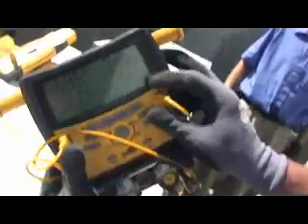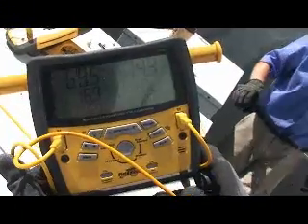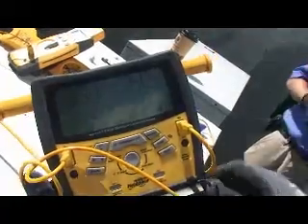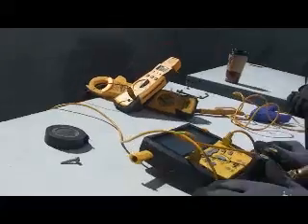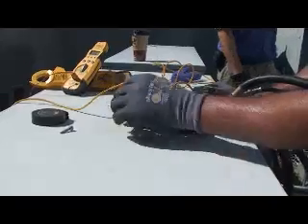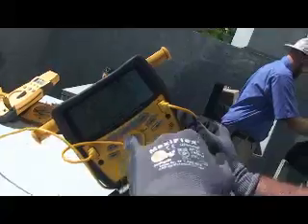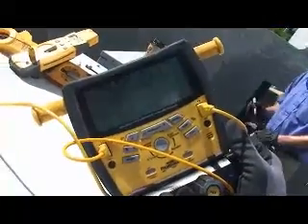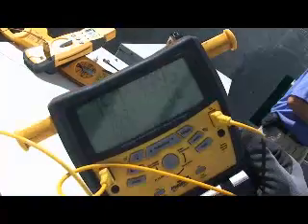See, right now this is saying I have a 0 degree subcool. The machine's not running, that's why. Machine shut off. There we go. I have a 15 degree superheat here. 15 to 20, pretty good superheat for this machine.